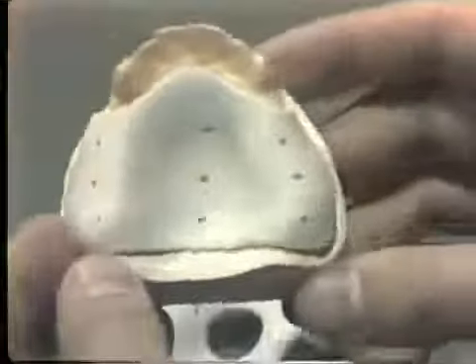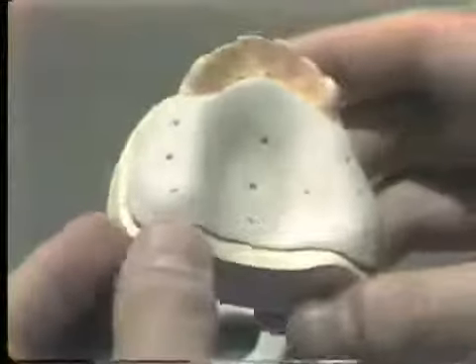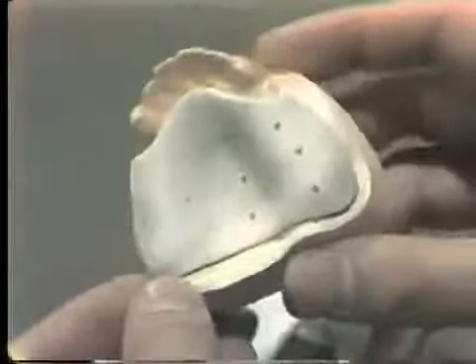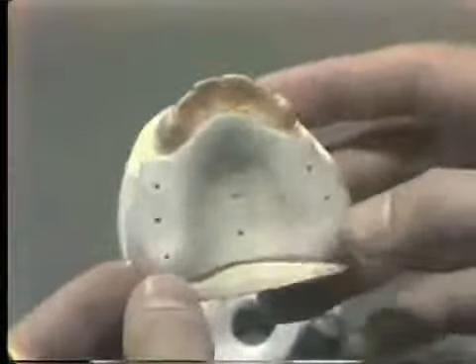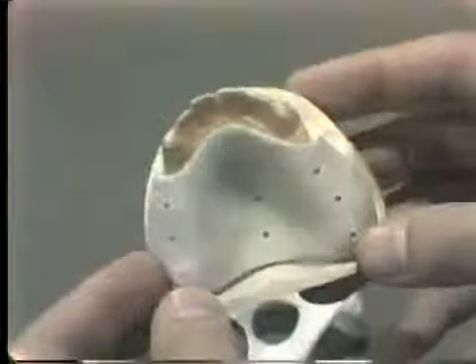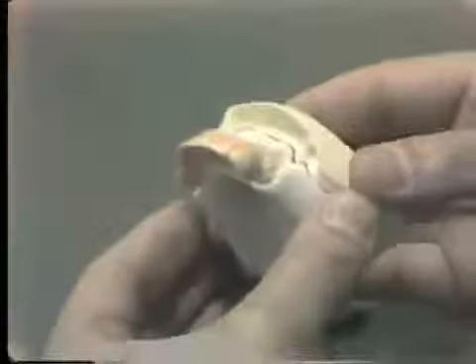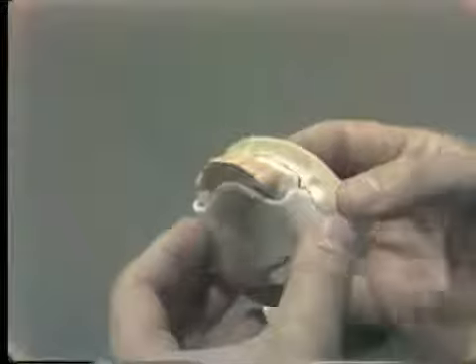And then this posterior segment, final impression, is taken in any wash medium, either a rubber base medium or a zinc oxide eugenol paste. After that impression is made, the first tray is taken out of the mouth, the peripheries are trimmed, and then this first tray is placed back in the mouth, making sure that it is seated correctly.